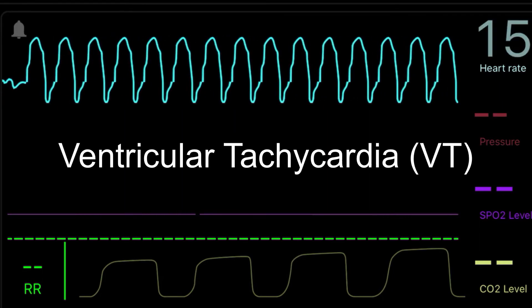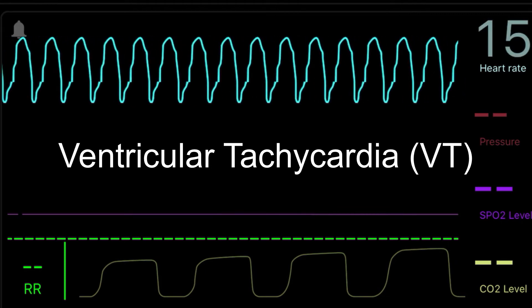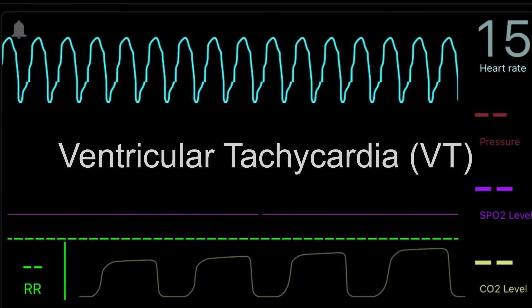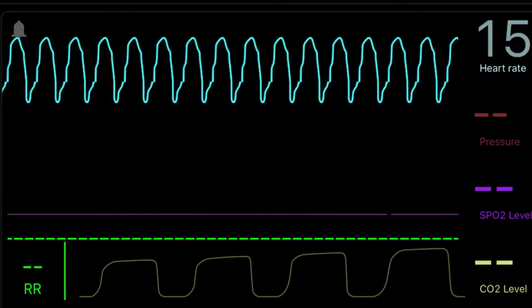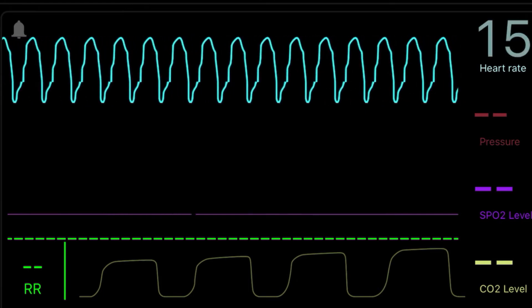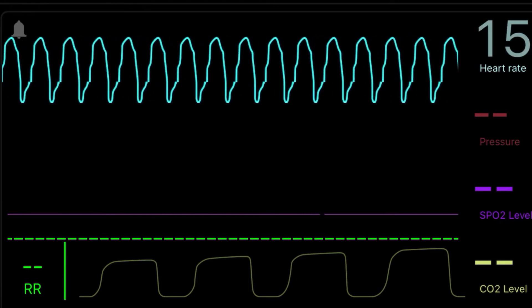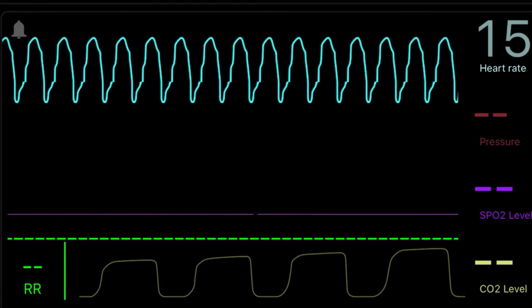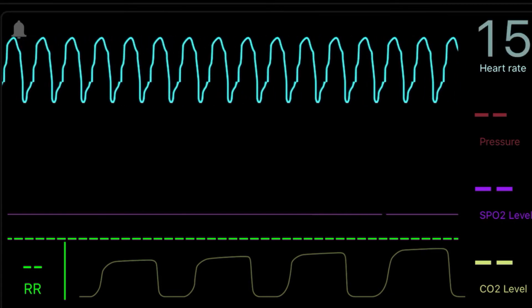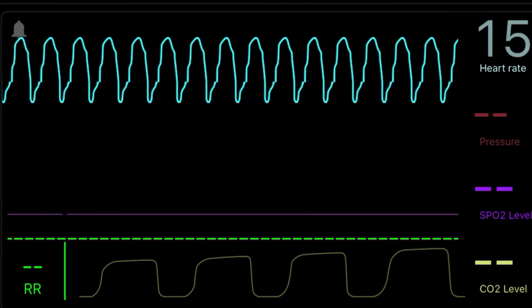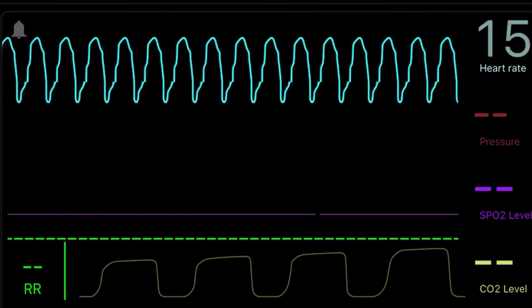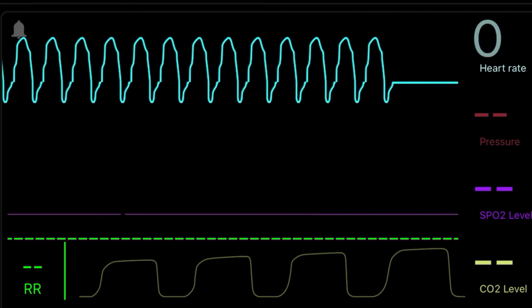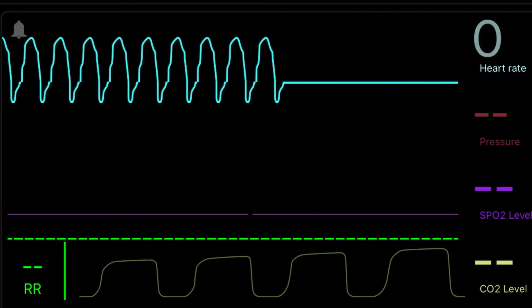This is ventricular tachycardia, and you can see that the rhythm looks much more regular than ventricular fibrillation. The patient may or may not have a pulse with this, which is why it is important that we only apply the AED to someone who is pulseless, because the AED may recognize this rhythm and shock it.